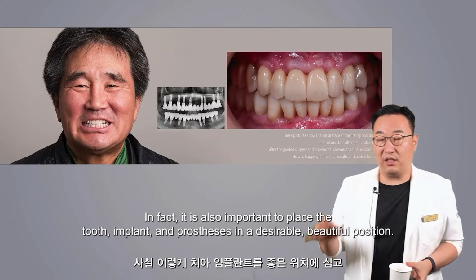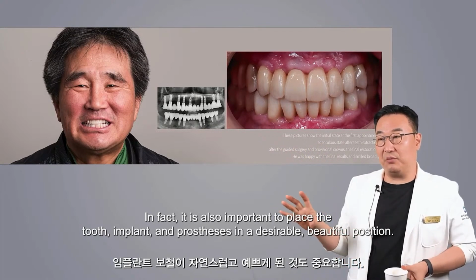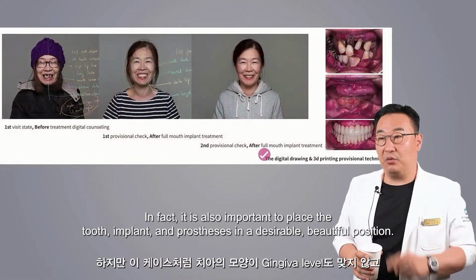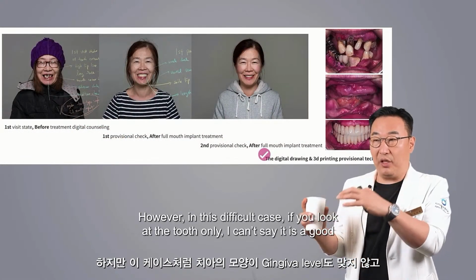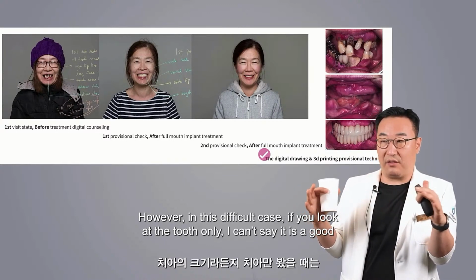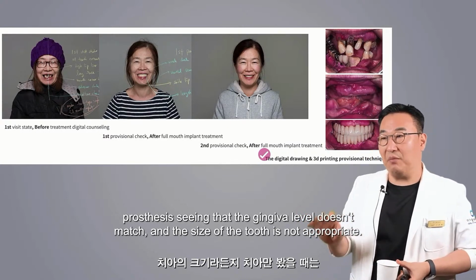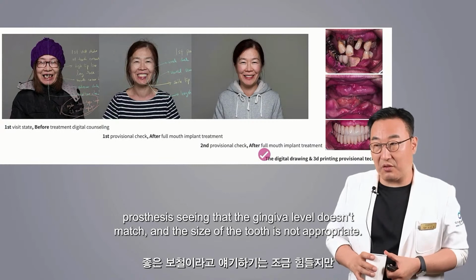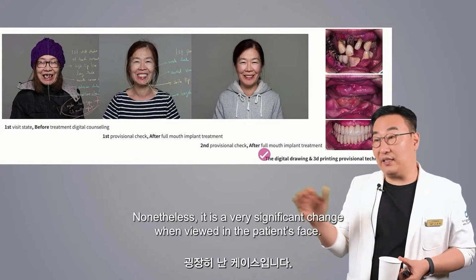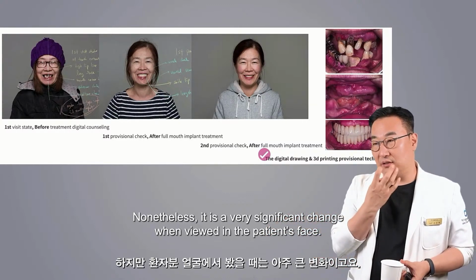In fact, it is also important to place the tooth, implant, and prostheses in a desirable, beautiful position. However, in this difficult case, if you look at the tooth only, I can't say it is a good prosthesis, seeing that the gingiva level doesn't match and the size of the tooth is not appropriate. Nonetheless, it is a very significant change when viewed in the patient's face.